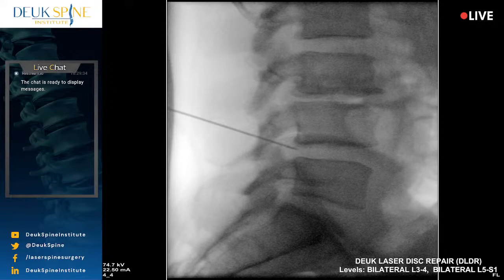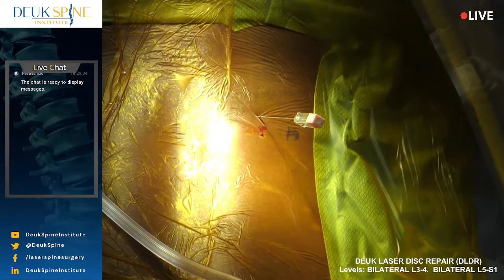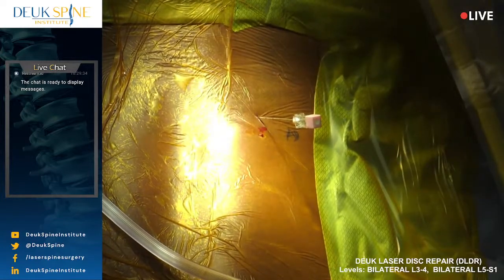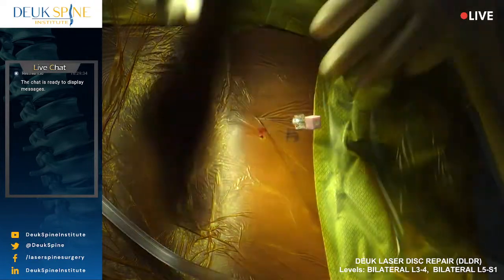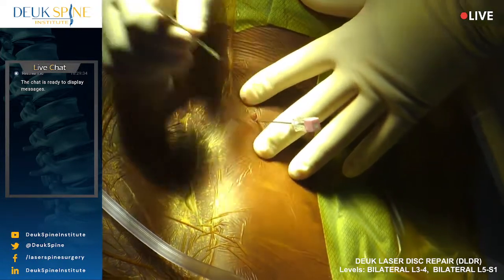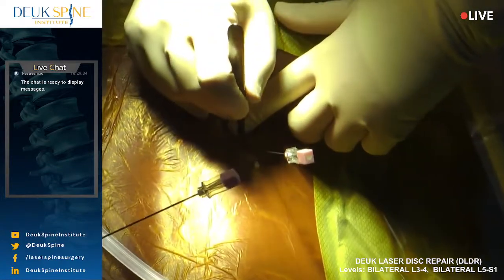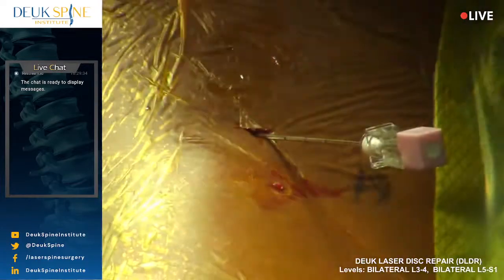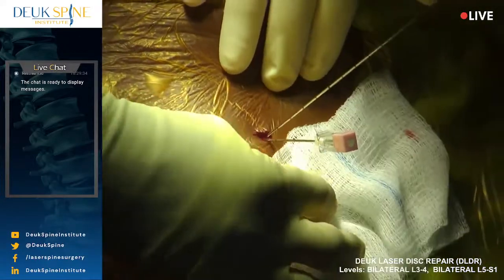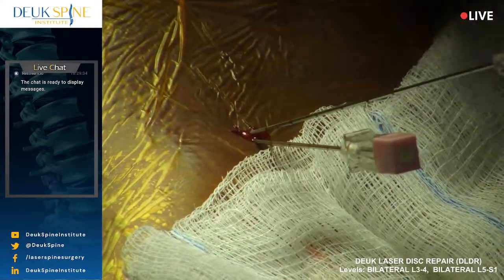Shot? Do you feel anything in your back there? A little bit? Massive herniation there, massive. All right. Incision. So we've got 1 in place. We got 4 to do. Let me know if it's uncomfortable, okay? Make our 7mm incision. So we're going to do the whole surgery through a 7mm incision. I want to make sure we get a nice clean incision. Once you make an incision, it's no longer a percutaneous procedure, it becomes a surgery. A lot of people don't know that.